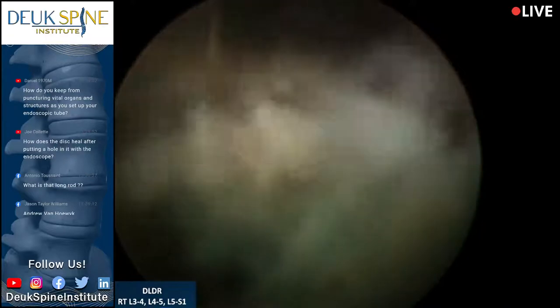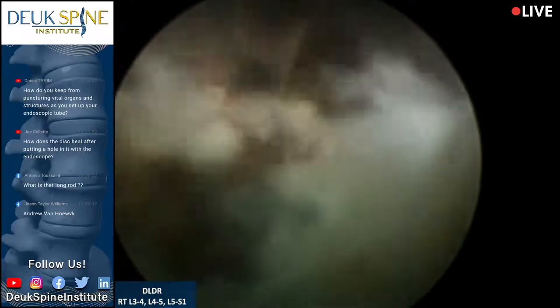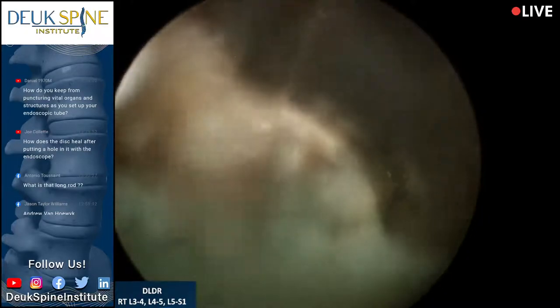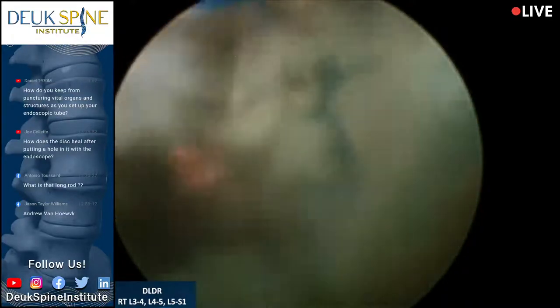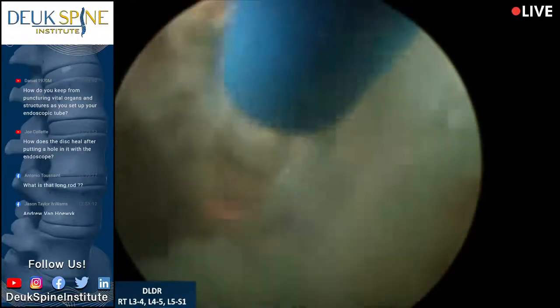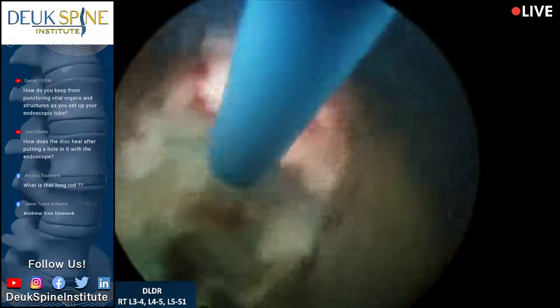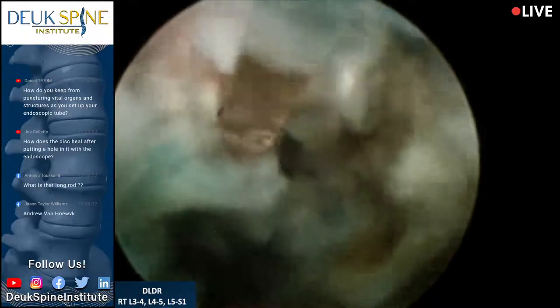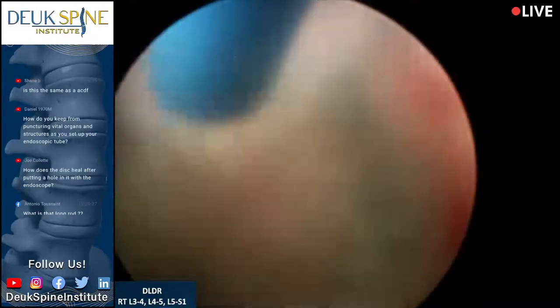It's important when you're dealing with these annular tears that you get the medial and lateral components. This is the lateral component I'm working on right now. But I need about 5 minutes, doctor, maybe less. Talking to my anesthesiologist, letting him know. These are all pieces of herniation, by the way. Each one of those shapes is its own herniation. There's so many. You can see just how many there are. This patient has a lot of herniated fragments here at L3-4.